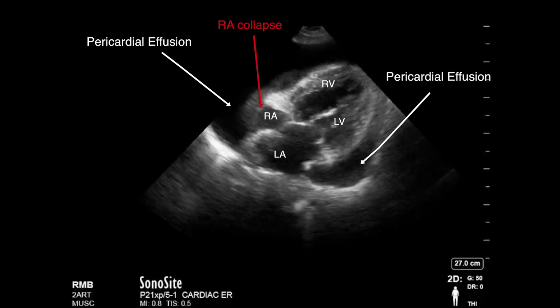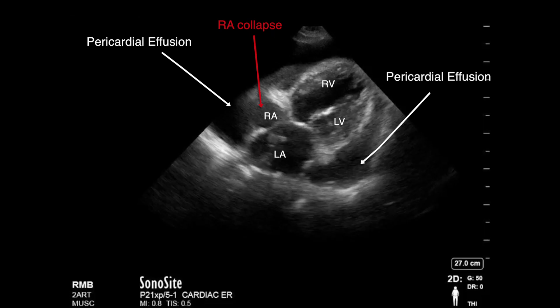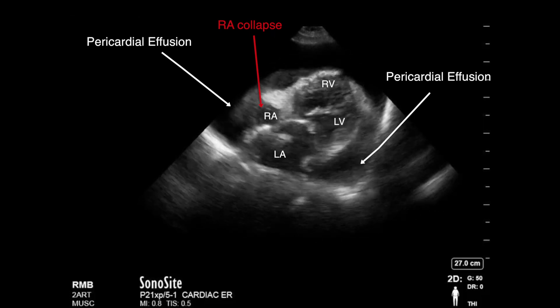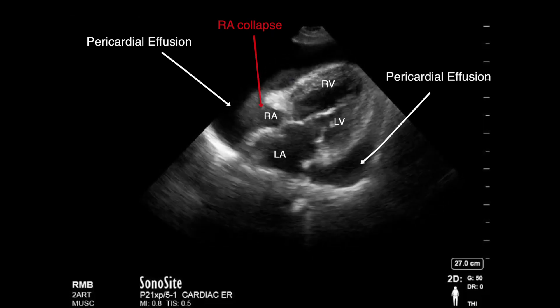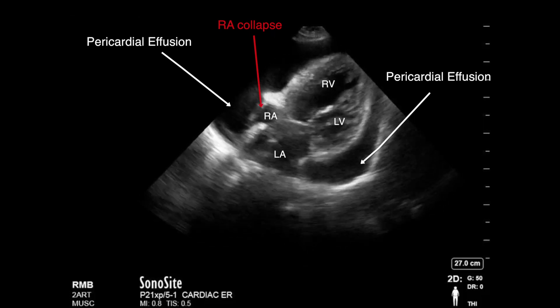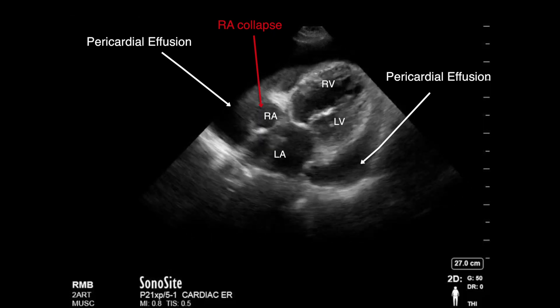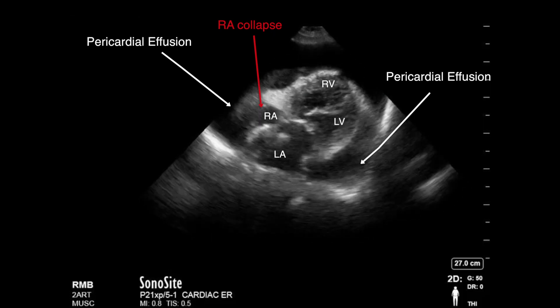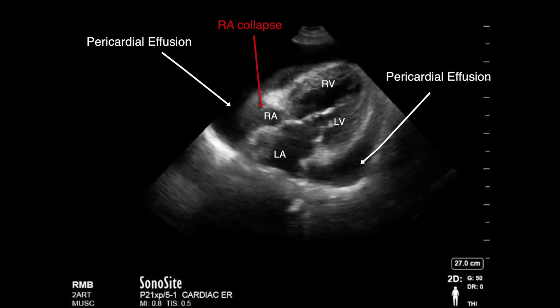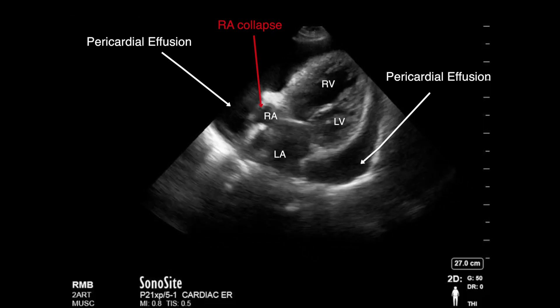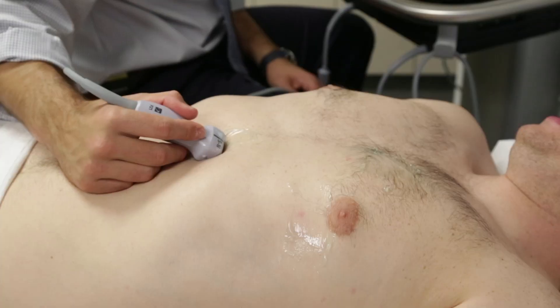Here are several clips of abnormalities identified in the subcostal four-chamber view. In this first clip, we have pericardial effusion identified with right atrial collapse seen, which would suggest tamponade physiology. Care must be taken to make sure that the axis is correct and not foreshortened.